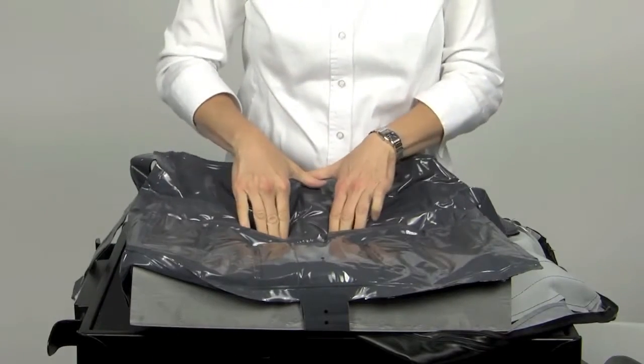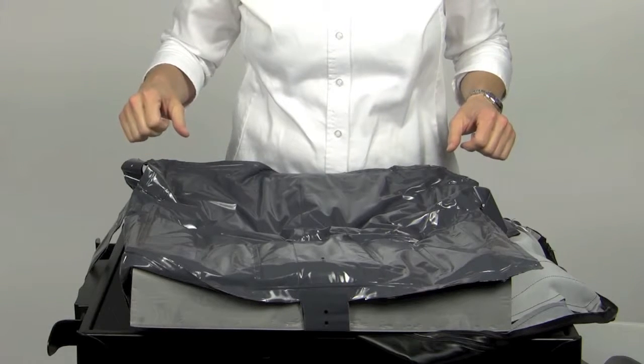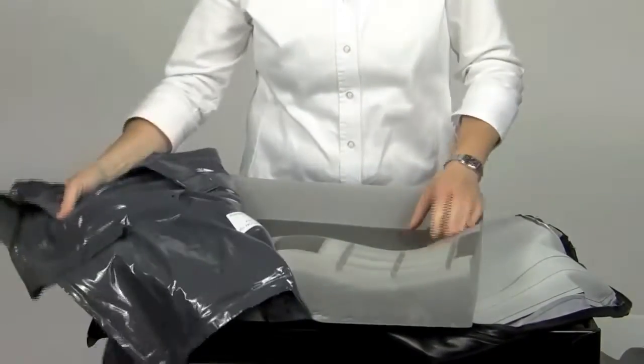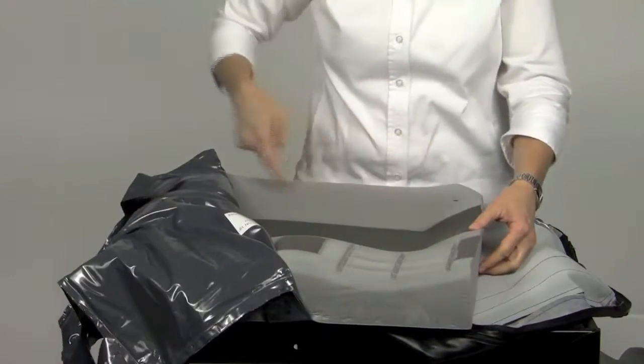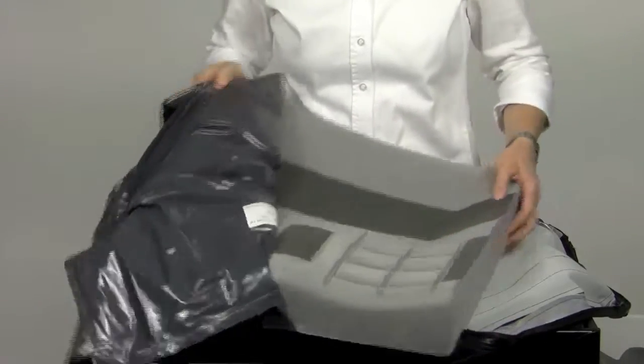Another advantage to this cushion is that the silicone fluid always flows to level, is maintenance free, and resists freezing. The fluid well is curved up at the rear to provide some sacral support and prevent the fluid from flowing out the back.